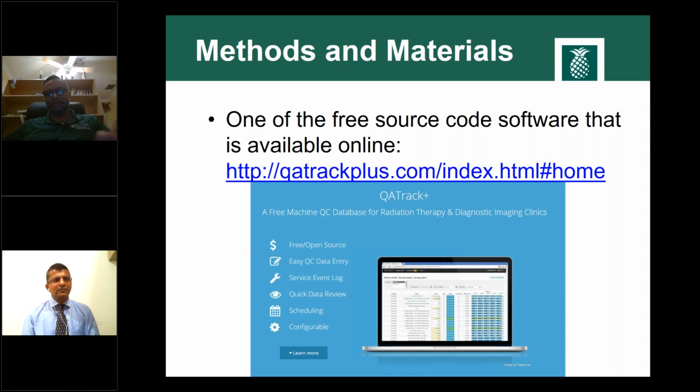Do your monthly, do your daily, do your annual. That is how we incorporate. We use the software for executing all the tests that are agreed and approved by the internal QA program. So we use TG100, TG275, all those TGs we select, and we pick and choose what kind of tests we need to do for this particular machine. And that's the advantage of the software. Rather than just depending on one particular document, you can actually harvest the best out of multiple documents and put it together at your fingertips to use.